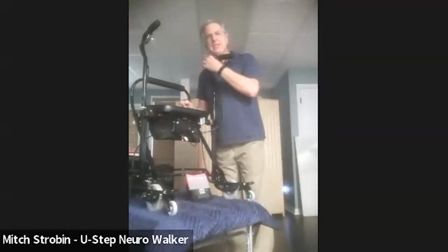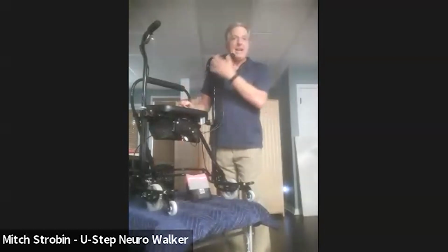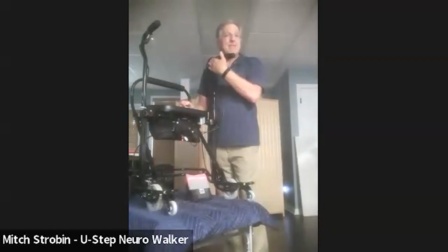So hopefully you can hear that. Okay, so I have it going pretty loud and very fast. I mean, who walks that fast? I don't know. But there's actually 15 different cadences or 15 different beats that one can set because everyone walks at a different pace or a different gait. So there's actually 15 different cadences you can set.